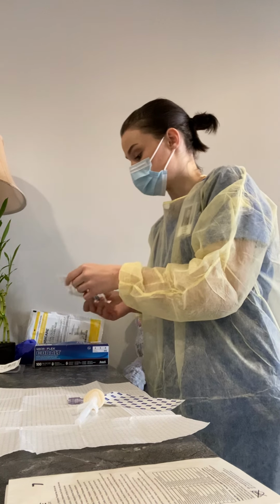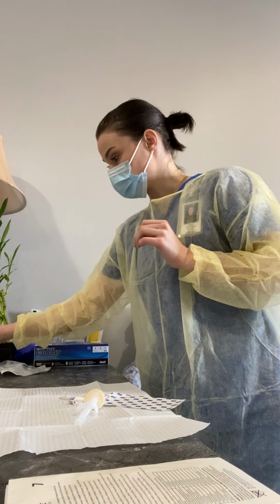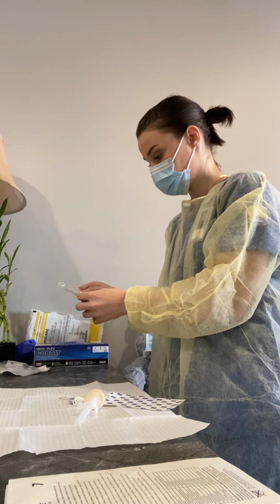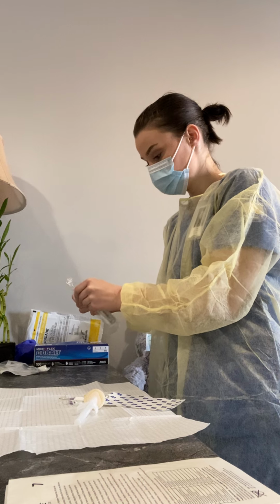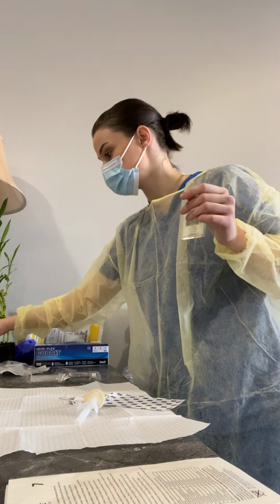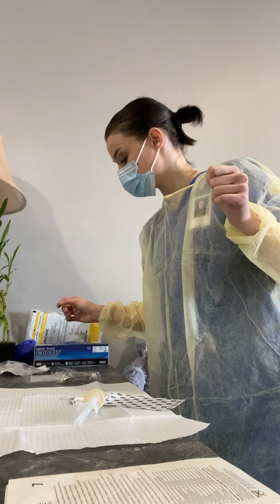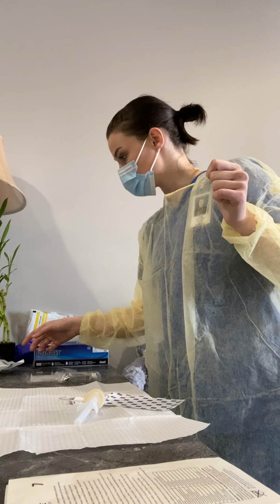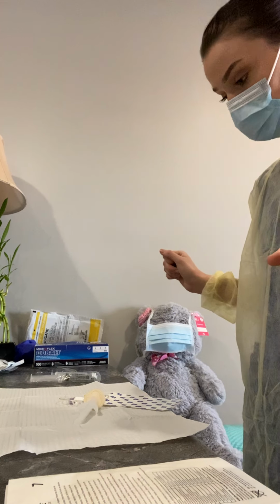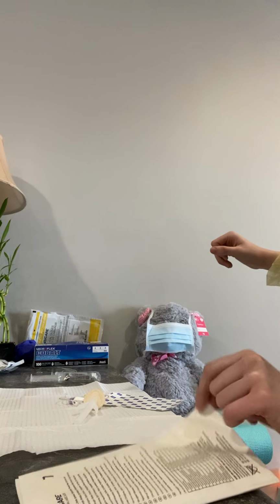And then I'm going to just get this ready. I will not put that on my sterile field. Okay, I think that I have got it all. Okay, so I'm going to go ahead and put on my sterile gloves.